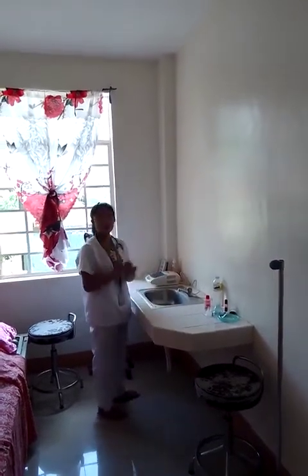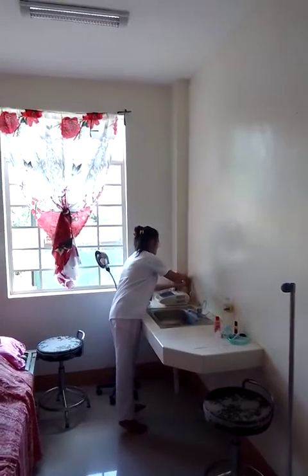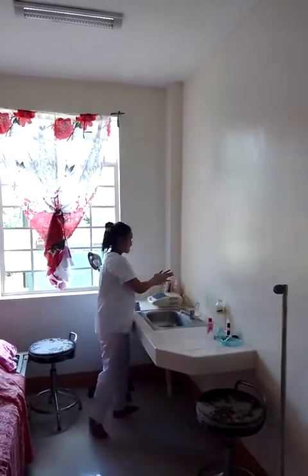After that, we should not forget to use alcohol. Again, it helps prevent the spread of microorganisms.